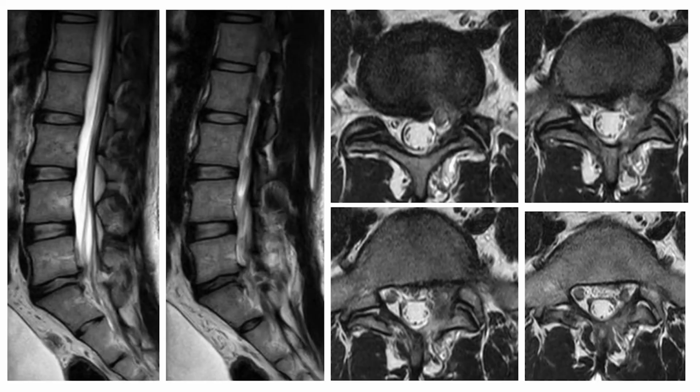Now let's see the post-operative MRI of this particular patient. This is the post-operative MRI. You can see we have removed the entire disc fragment. At the same time, we have removed the hard annular hump as well.